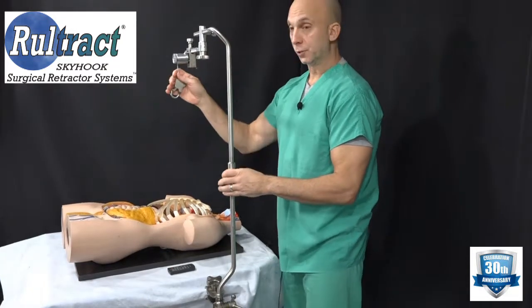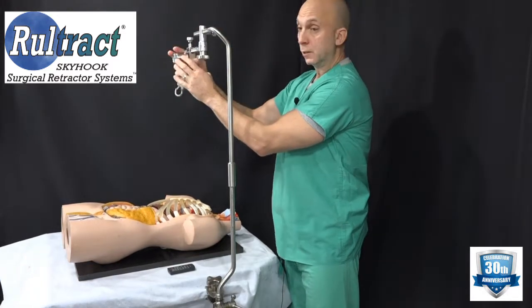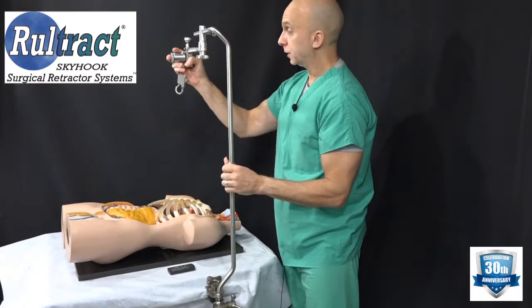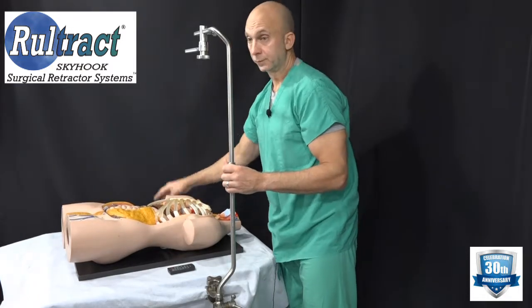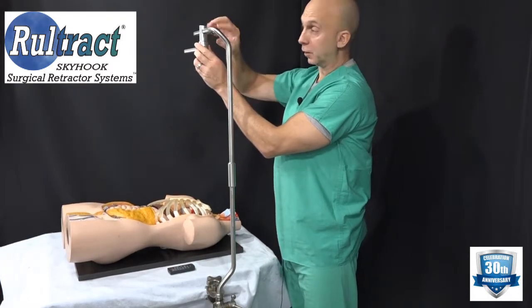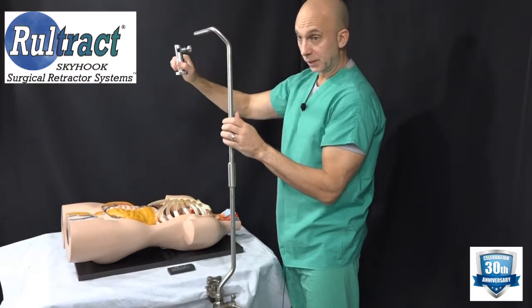First, wind the cable. Second, turn the lock knob, grasp the ratchet firmly, and slide it off. Next, take your rotating extender bar, turn the lock knob, hold it firmly, and slide it off.